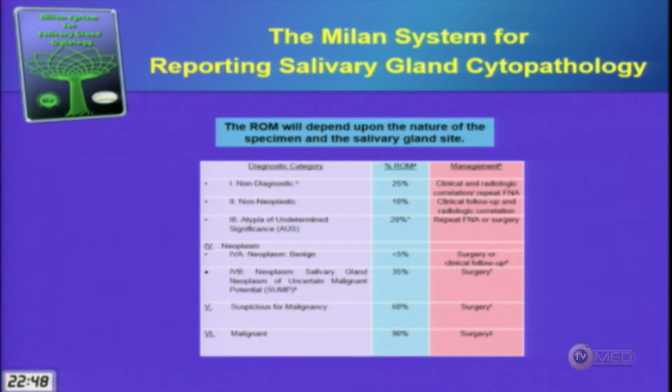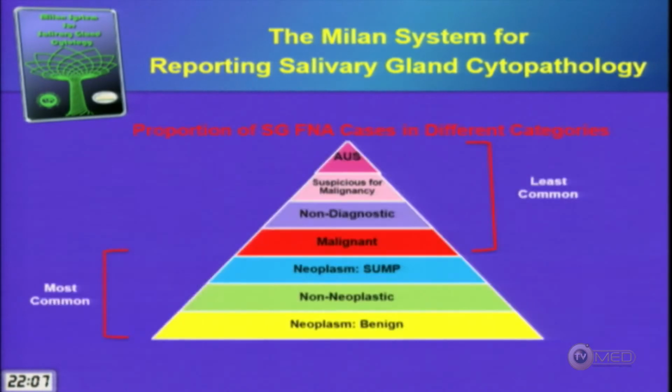I will say, and this is also true in the thyroid Bethesda, that the non-diagnostic category does have a little bit of an elevated risk of malignancy, and that's because, especially if you're not using ultrasound guidance, you may actually miss the salivary gland lesion. But what I'd like to point out as well is that as we go from the atypical category of about 20% risk of malignancy up to the uncertain malignant potential category of 35%, and then further up we go to 60%, and then closer to 90% as we move through the suspicious and malignant categories.